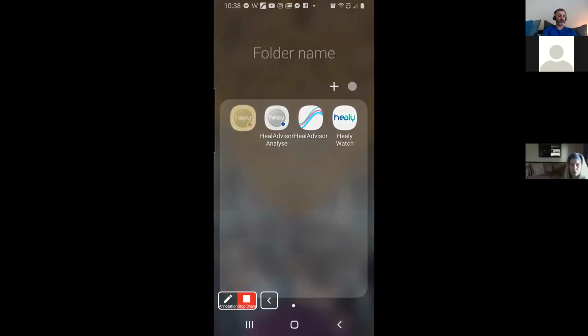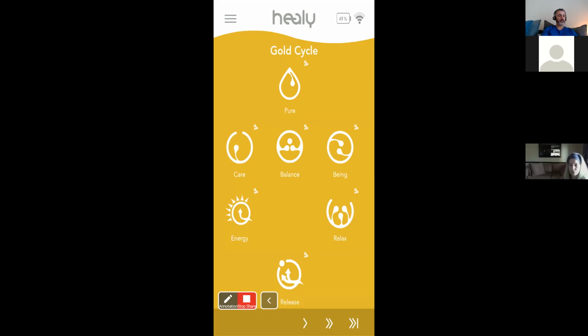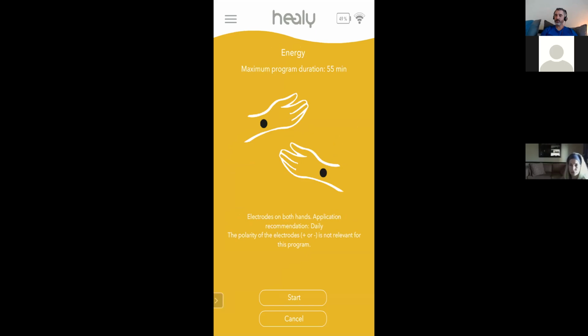All right, back to the program. So I'm going to run the energy program, because it'd be great to have as much energy as possible for this. And what you see is it tells you where to use it, electrodes on both hands.